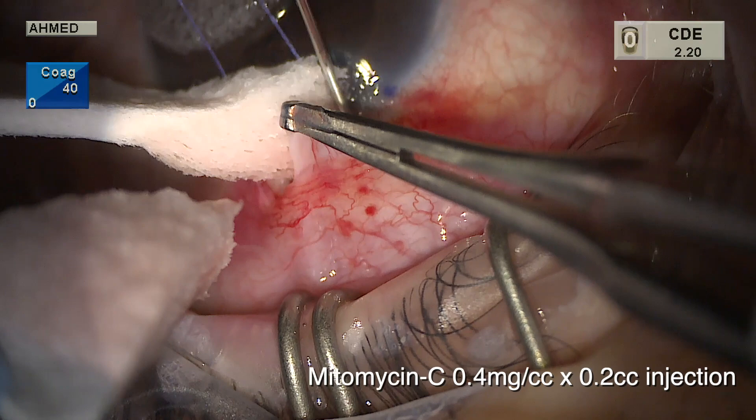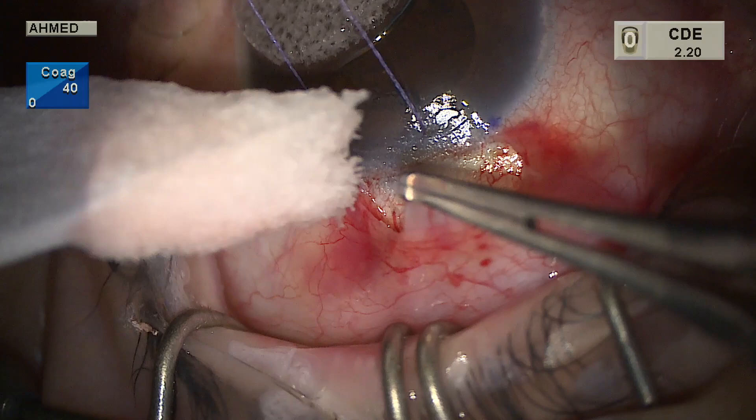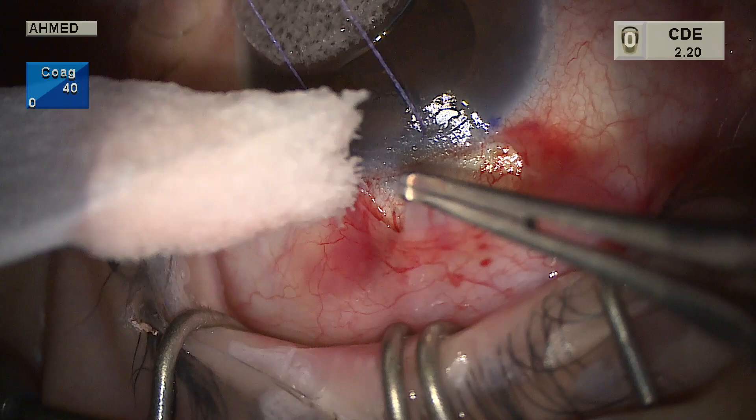This technique avoids sponges and provides a direct titrated dose to the delivery site. We prefer to avoid injecting mitomycin prior to dissection, as this causes Tenon's to hydrate and makes the dissection difficult to lift off the sclera.